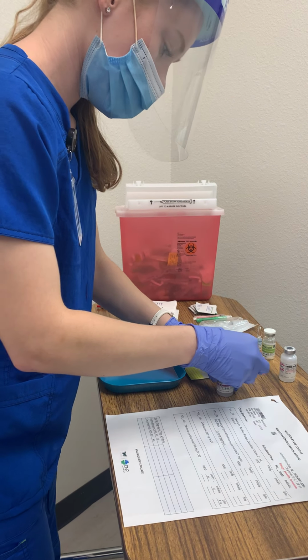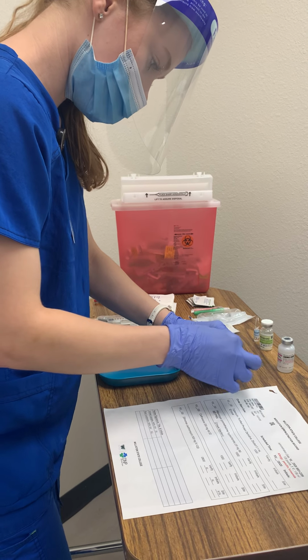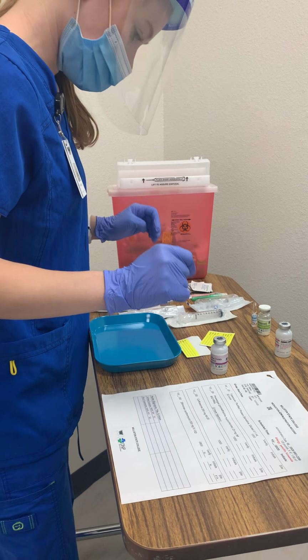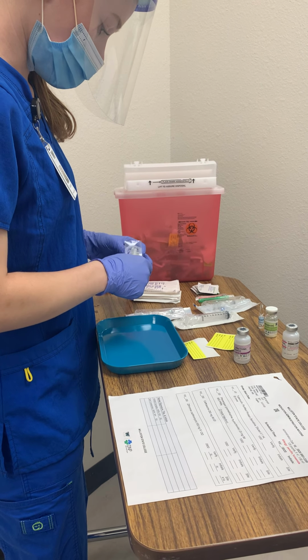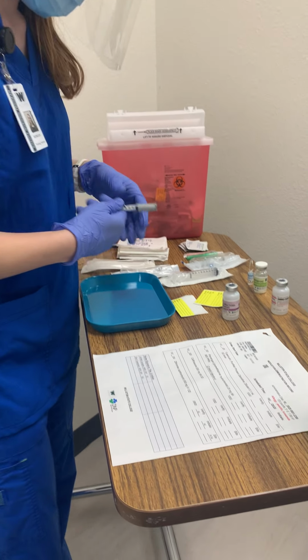And then I'm gonna wipe it for 10 to 15 seconds, and let that air dry. With my dimensional analysis, I know I'll be drawing up 0.1 mL.